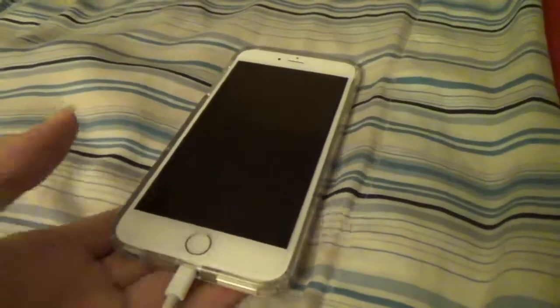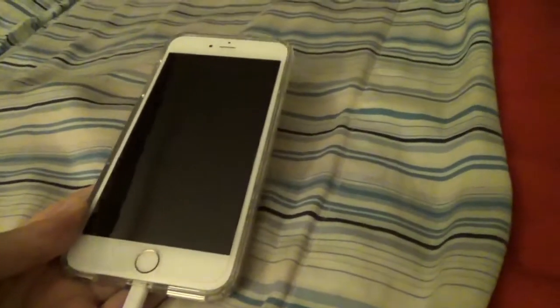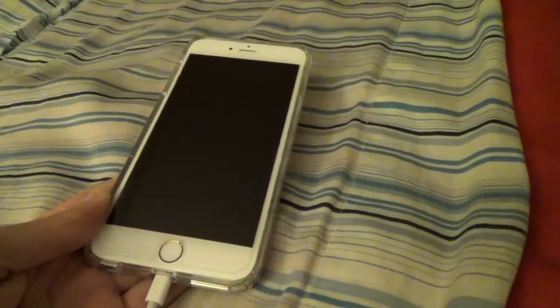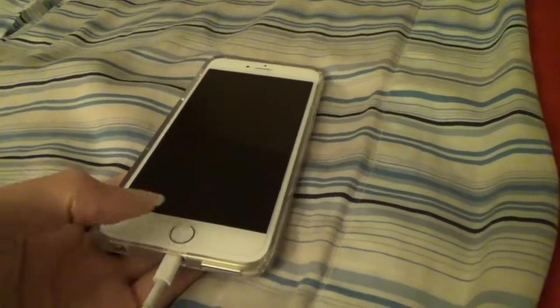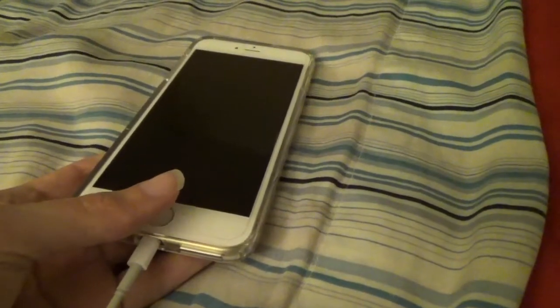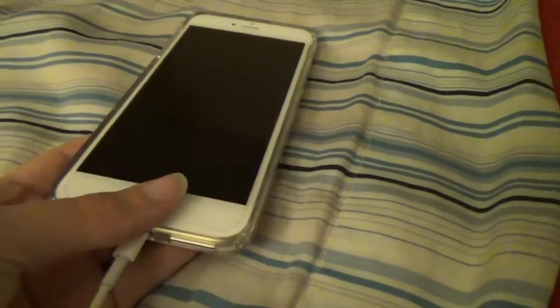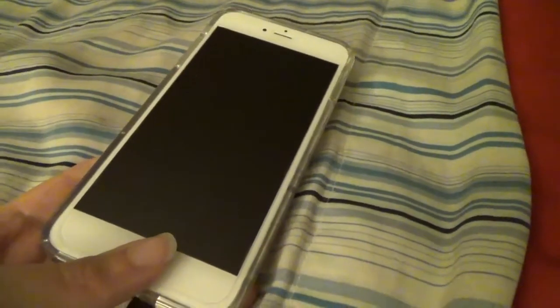So in this video I'm going to share with you one of the main reasons I got the iPhone. I made a mention in one of my prior videos that there was a piece of software that could replace a portable video magnifier such as the Pebble or any of the Optilec models, anything portable, a Freedom Scientific Ruby. This could effectively replace them.